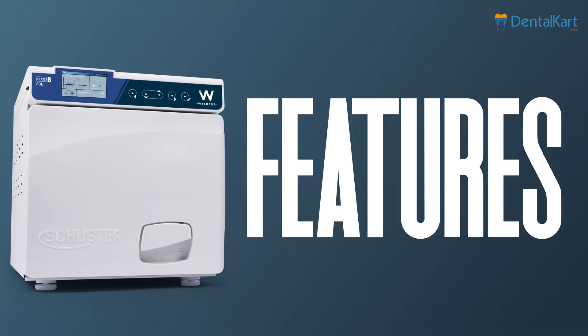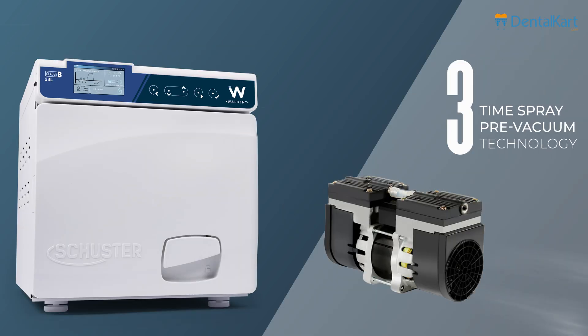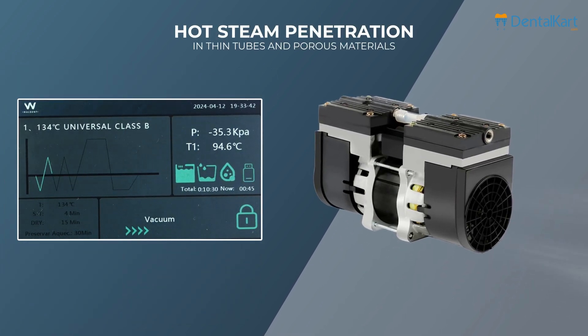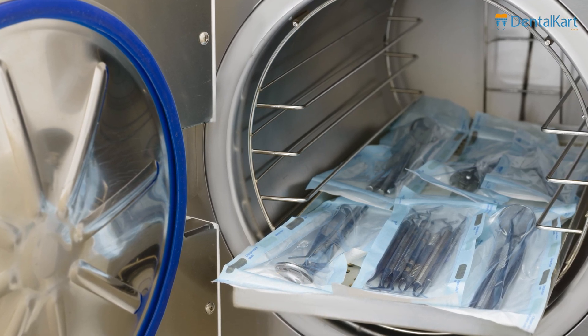Let's explore the features of the Walden Schuster Class B Autoclave. Pre-Vacuum Steam Sterilization: the advanced three times pre-vacuum technology ensures hot steam penetration in thin tubes and porous materials, providing efficient sterilization for a wide range of instruments.